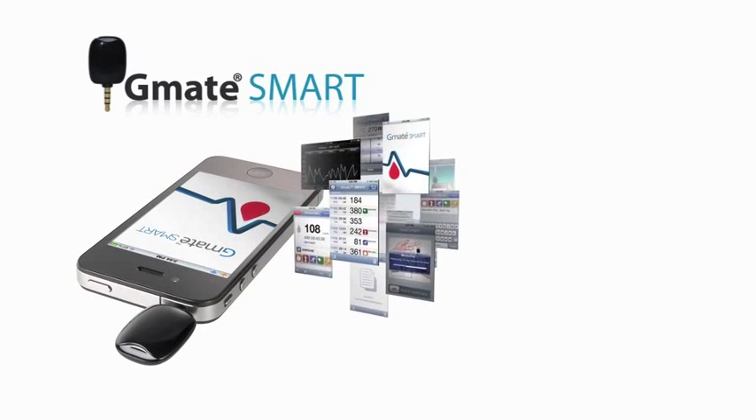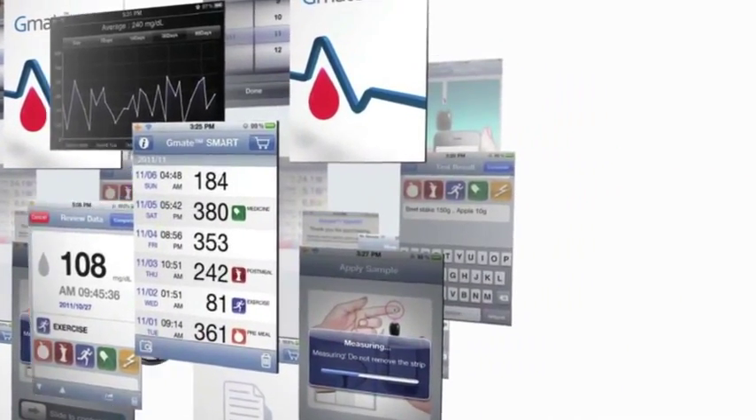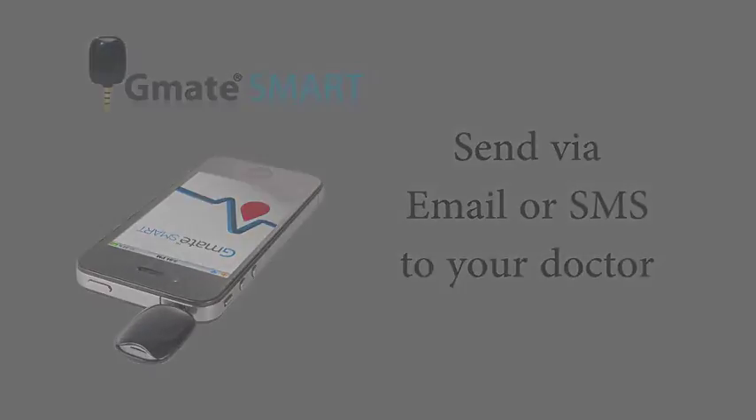The application keeps track of all the results and is even capable of emailing or SMS-ing the results to your doctor. Now you can say goodbye to your logbook.